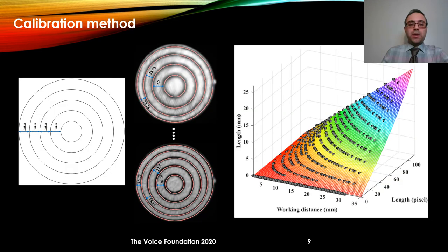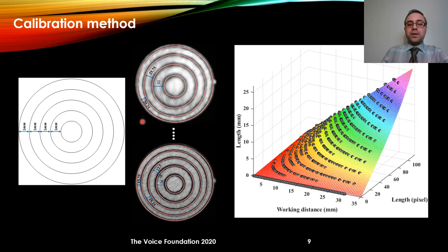The proposed calibration approach is based on circular grids. We created a set of concentric circles with a fixed distance between consecutive circles, for example one millimeter. We recorded this grid from multiple working distances and then segmented all of those circles in the image. As we move from the center toward the periphery, the distance between consecutive circles decreases, clearly showing the effect of nonlinear distortion.